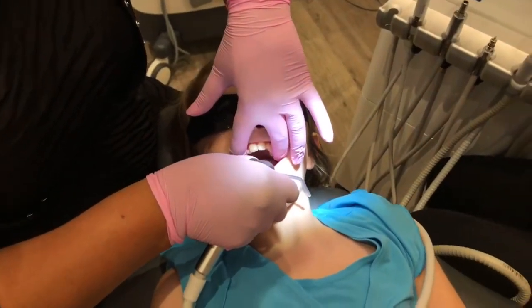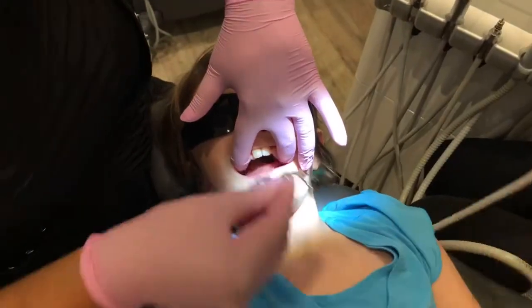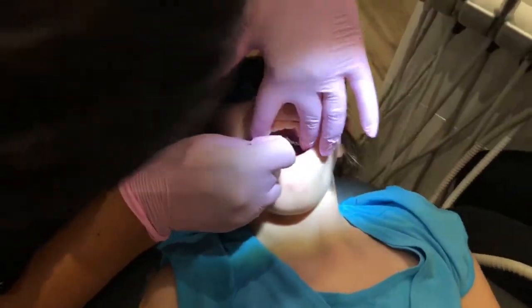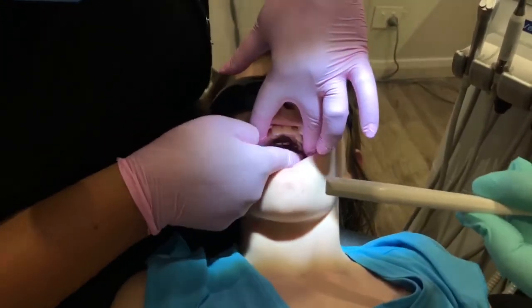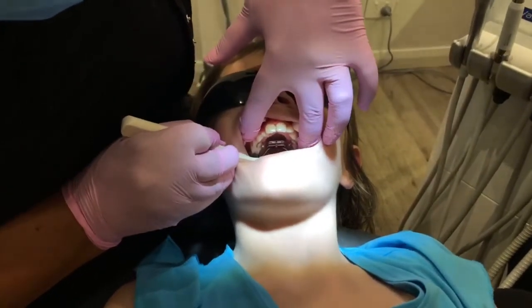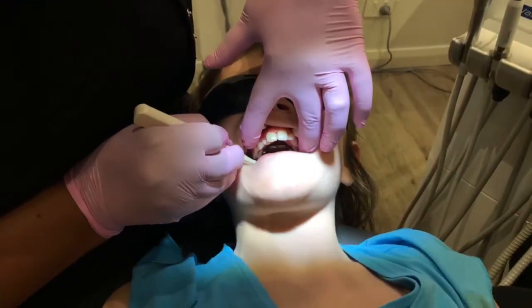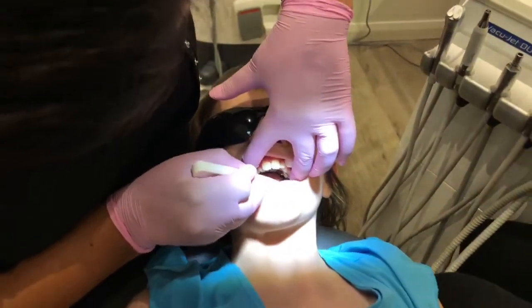Really good. So now I've got it really isolated and dry. I told you it's going to taste a little bit sour. So go bite hard for me — bite really hard. Open again. Bite hard here — chomp down.